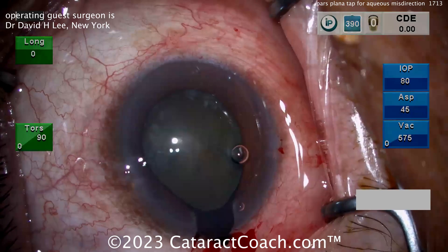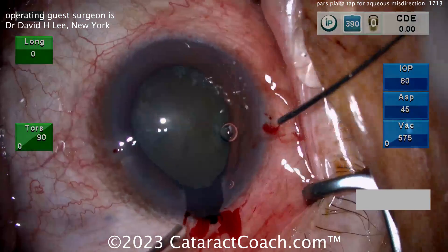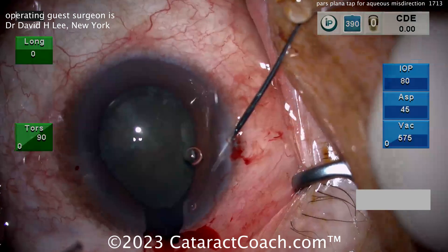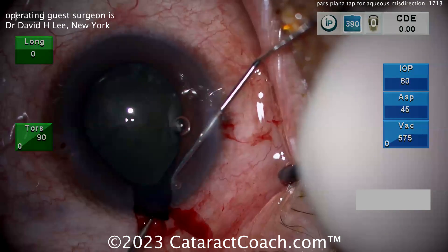That's what the surgeon is thinking here. I know the video is not in high definition — I love high definition videos — but I had to show you this because I don't have another video of this exact maneuver. So going inside the eye and trying to sweep the iris back in is okay, but that's just a temporary thing — it's not going to work.